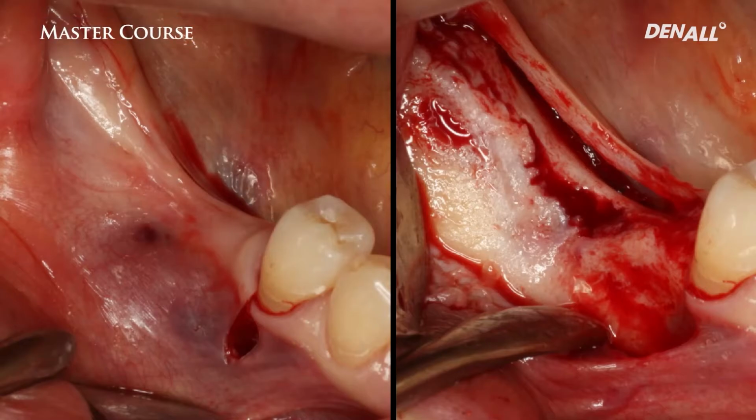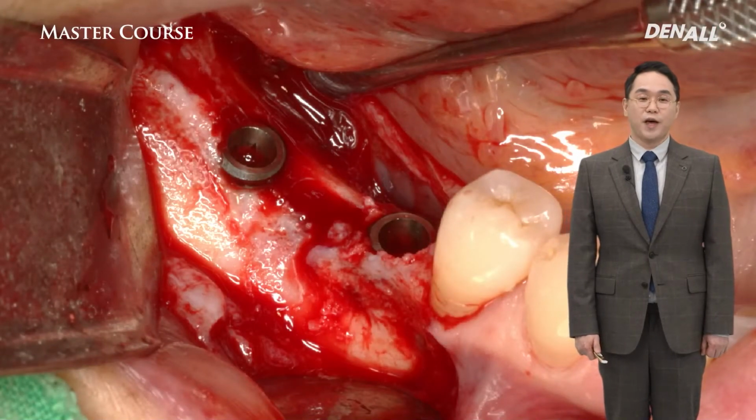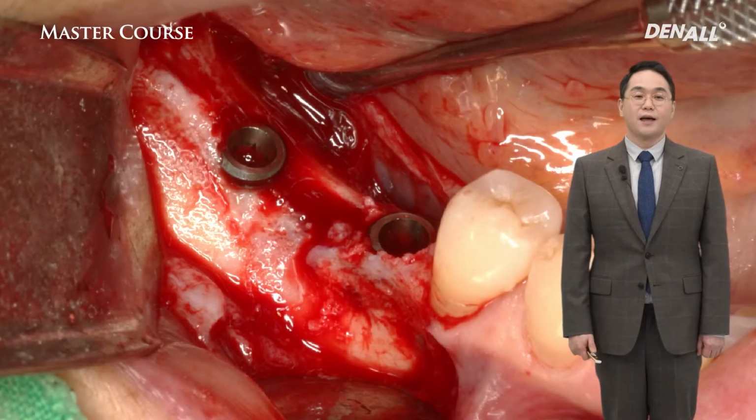On the upper jaw, all teeth 14, 15, and 16 except 17 had a big vertical bone deficiency, and the bone quality was poor, and the distance to the sinus floor is extremely limited, hard to achieve primary stability, so it is not possible to place implants. But we could place implants in mandible at number 46 and 47 before performing bone augmentation. So we placed 2 implants at 46 and 47.